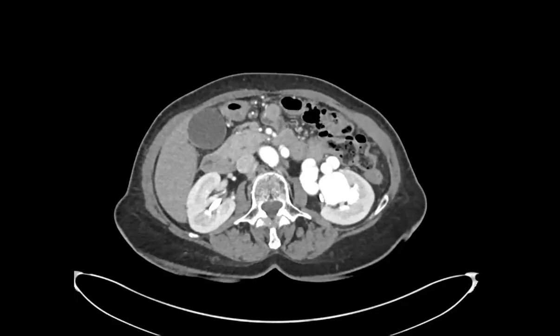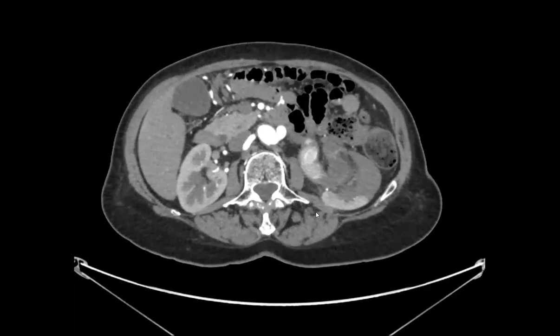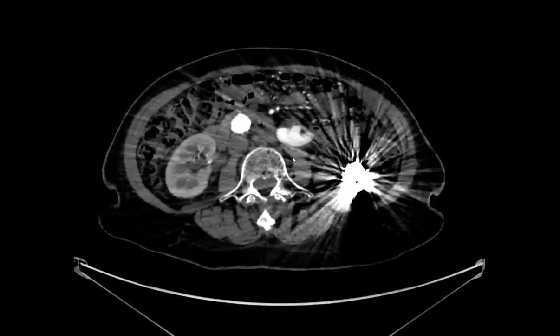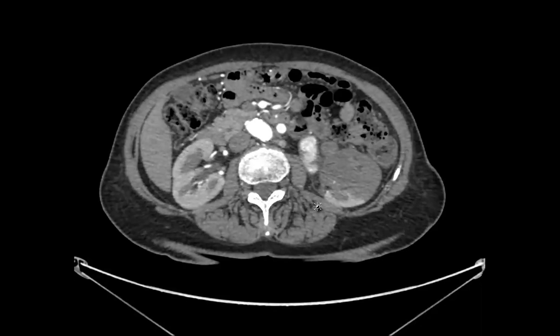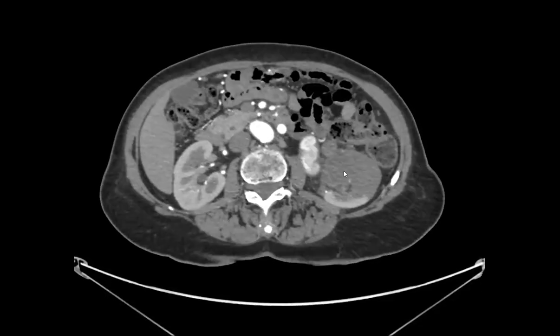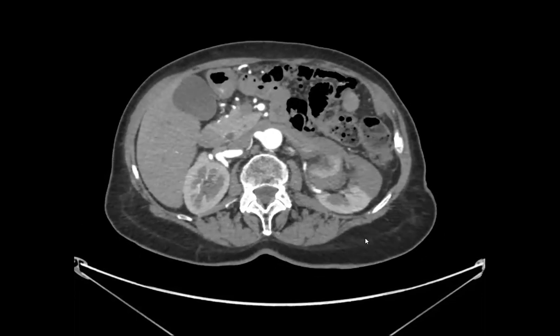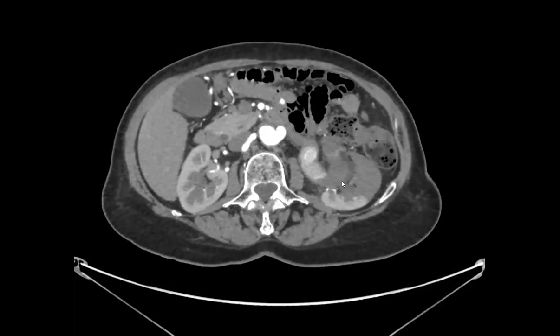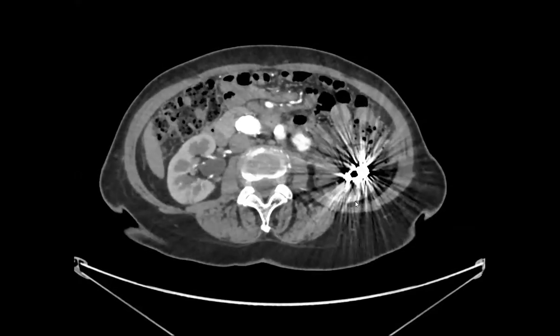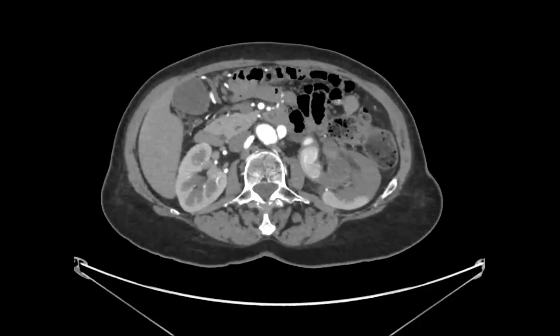The AVM was treated with embolization by IR, and I'll just show you the post. Here you can see there's still some filling of that artery proximally, but there's a big coil pack in here, and basically the whole nidus is devascularized. So it was a successful coiling of an AVM. Nice. Very nice case. There's some infarct or ischemia as well of the renal parenchyma. Yeah, I think they were okay with killing off that part of the kidney because they just wanted it to not rupture. Right. Yeah.